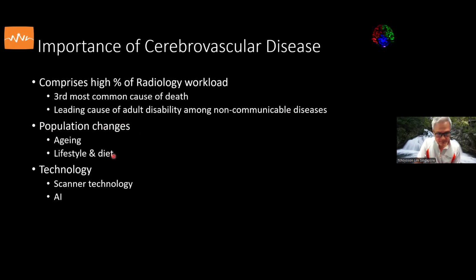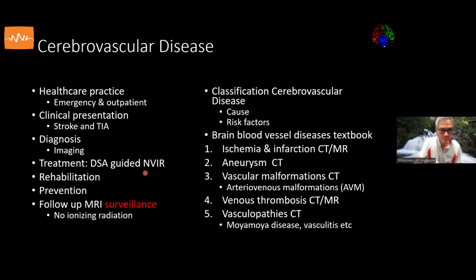The scanners that we have been purchasing for our CT and MR have been increasing in their technology, as well as the new artificial intelligence methods that we will be using. I will talk about practice in healthcare, a bit less for research, except in the area of applied research, where we use pulse sequences for the purposes of daily practice in serving our patients.